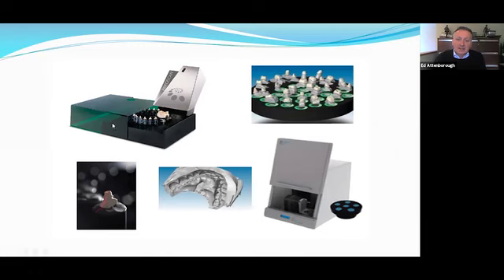The scanning technologies here are typically, on a desktop scanner, accurate to around 5 to 10 micron. They output in an industry standard open file format, which is called STL. So once the scanner's recorded the point cloud of data by rotating the object under the laser beam, it then takes all of that point cloud, individual points in X, Y, Z space, and changes it into a triangle mesh, which represents the surface anatomy of the object that's being scanned.